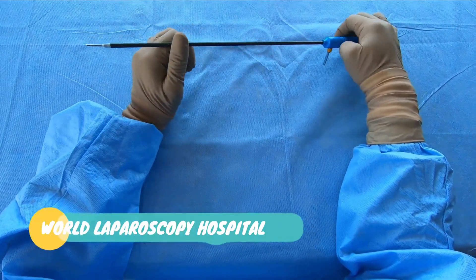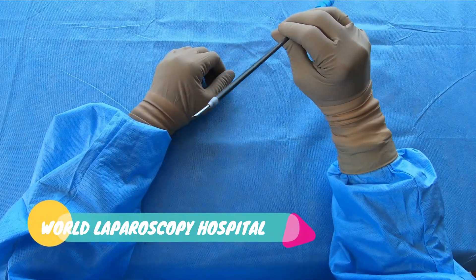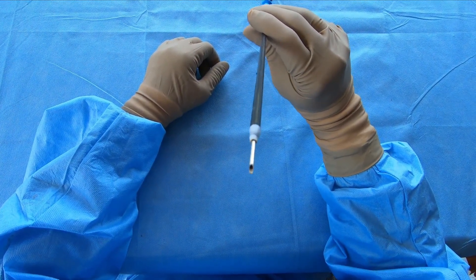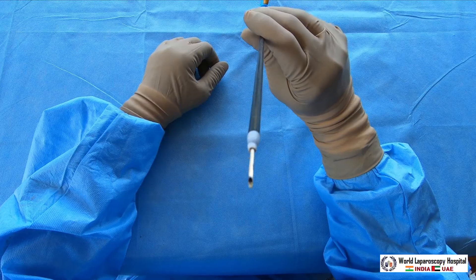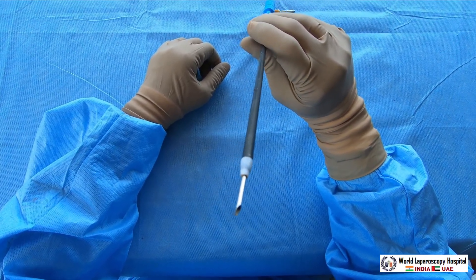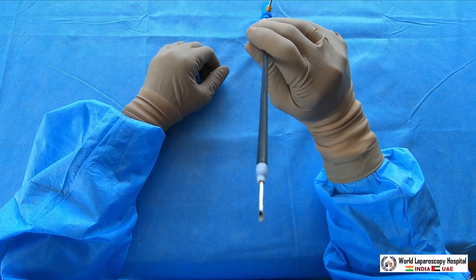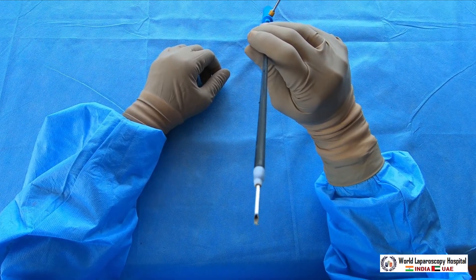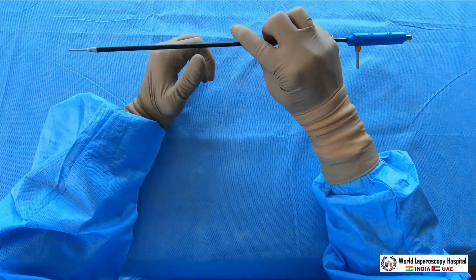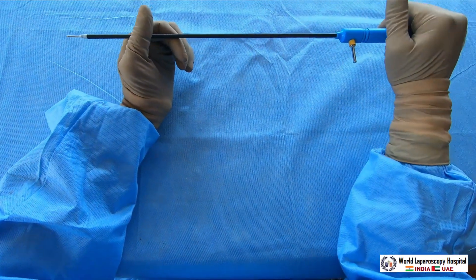Hello friend, today I am going to demonstrate the aspiration needle. This is a very useful instrument. You can see the tip of this needle is just like a simple coring needle, but the inside diameter is 0.8 mm. This is a 5 mm instrument.